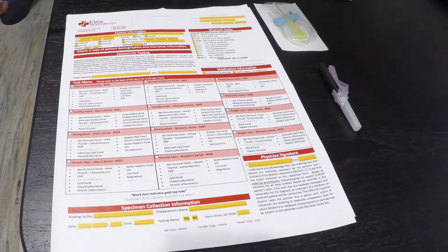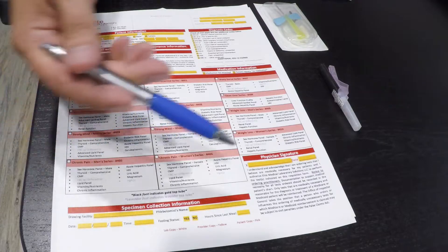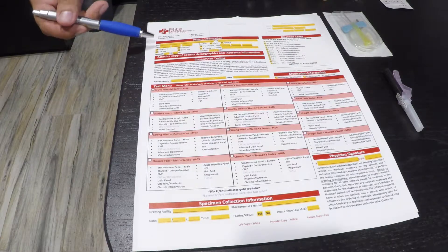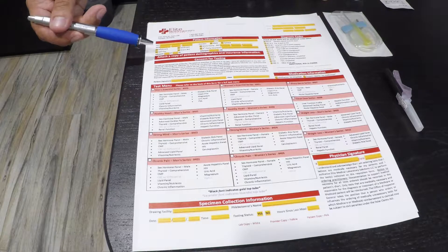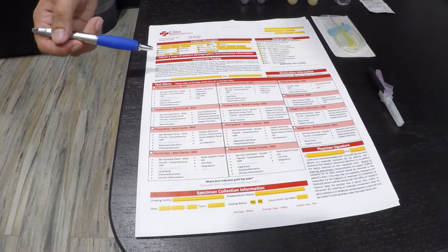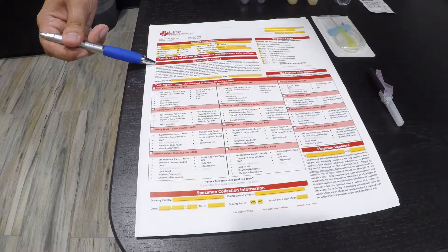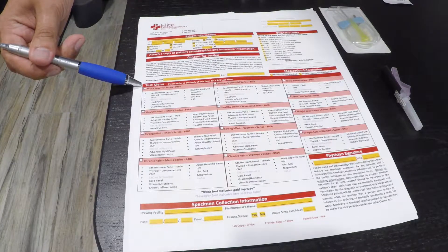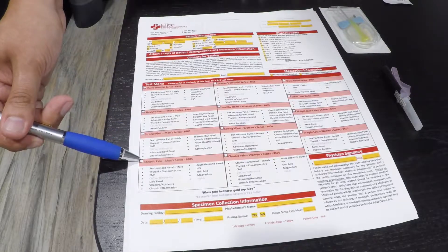We are now going to go over the blood wellness requisition form. We have highlighted all the mandatory fields. The MA will need to provide name, date of birth, gender, and height and weight. The MA will need to get consent from the patient and the patient must sign below. The MA will then check off which test panel the provider has selected.